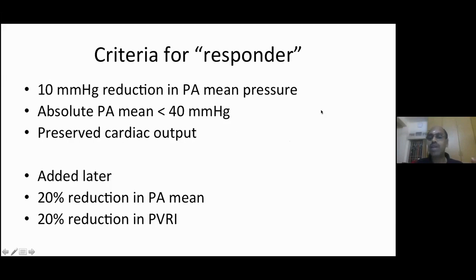In supraventricular tachycardia, we give an urgent bolus, whereas here it is an infusion. It is given more like how you give adenosine for stress myocardial perfusion scan imaging, or how you use it for coronary flow reserve testing. It is given as a sustained infusion. Adenosine is not given as a bolus.